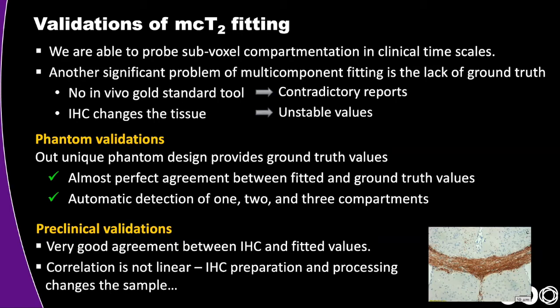I would also like to say that histology is not necessarily linear. It's not that if this brown area is twice as brown, it means that we have twice the myelin content. So one should regard histology results with some caution, especially if you look at it quantitatively.